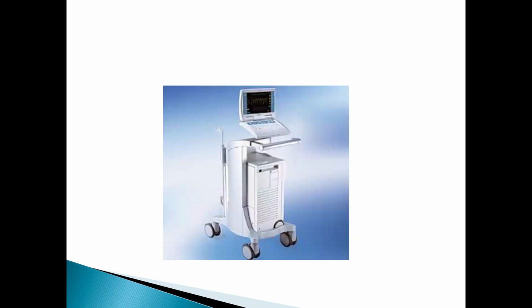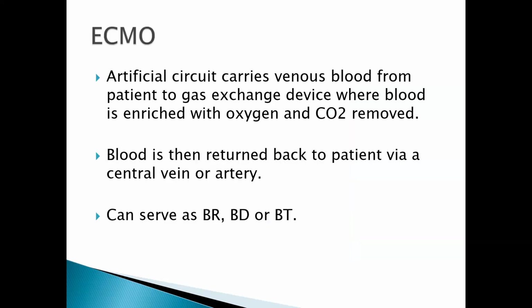Okay, this is a picture of what an intra-aortic balloon pump looks like. To be frank, this machine is quite big, and I just had to put this up so that we can see what it looks like. Next slide, please. So this ECMO simply means the extracorporeal membrane oxygenation.